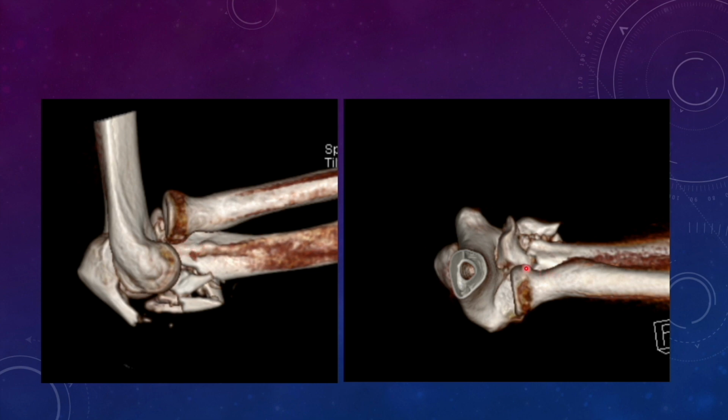In this image also you see it is from the anterior side. The anteromedial facet and the anterolateral facet are a single chunk, while the sublime tubercle, which should have been lying here, is lying somewhere here. And the radial head is still articulating with the anterolateral facet at the area of the sigmoid notch, but it is subluxated anteriorly along with the proximal ulna.